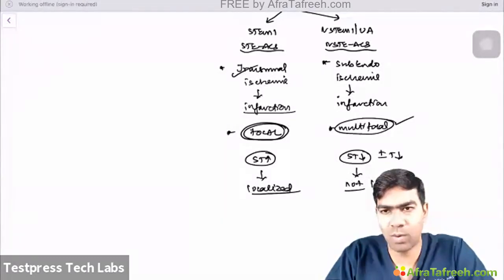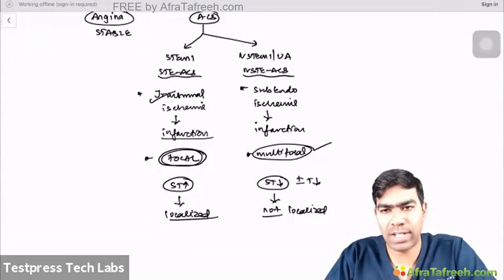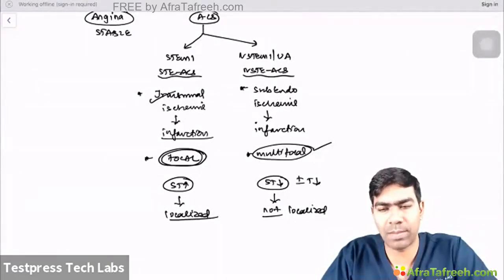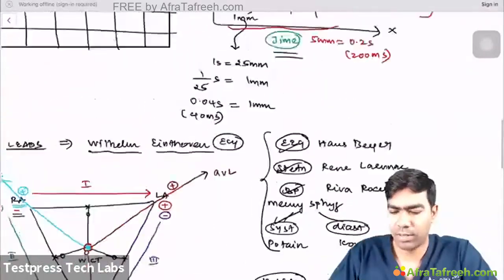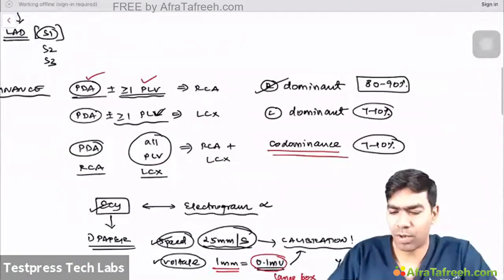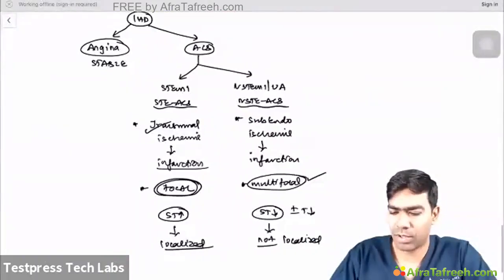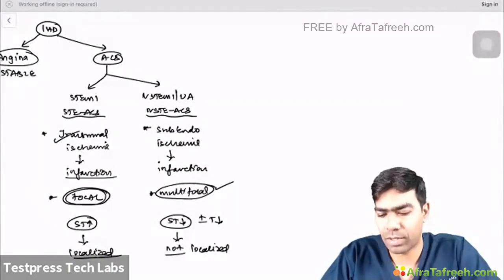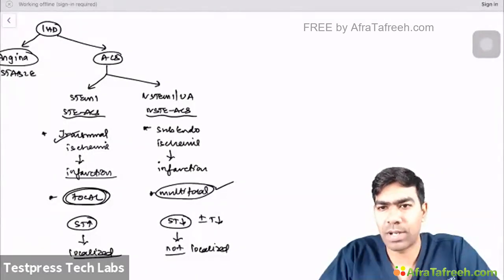Let us see how this really happens. And first of all, you need to know what is an ST segment. I'm going to discuss a whole lot of detail about what an ST segment is later on also. But because we have understood the anatomy better now, because I have discussed a lot about anatomy before, and I've discussed a lot about the lead system, right now is the best time to tell about the different localization of the STEMI. Reason for depression, elevation, relation to hypoxia, ischemia, necrosis.